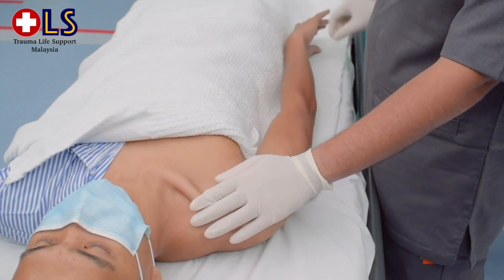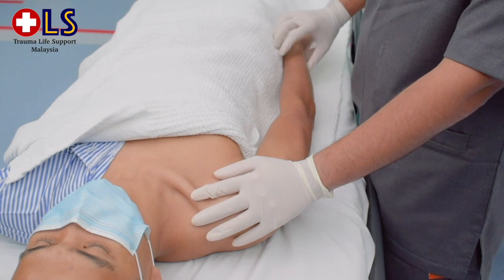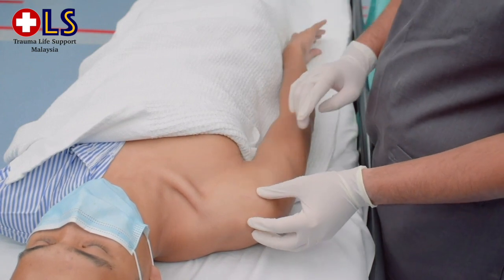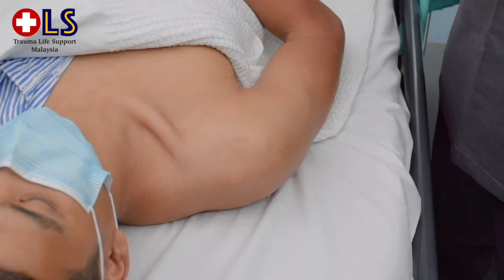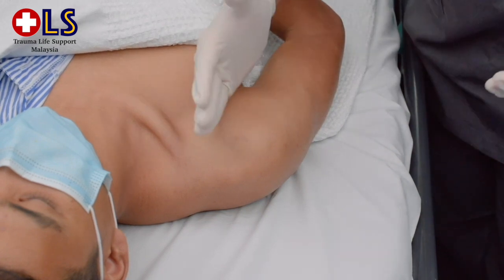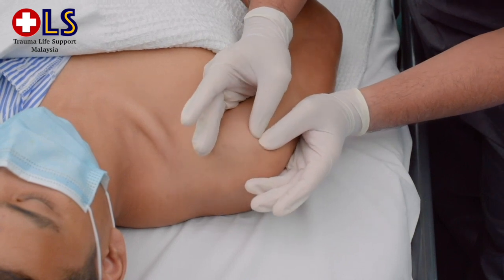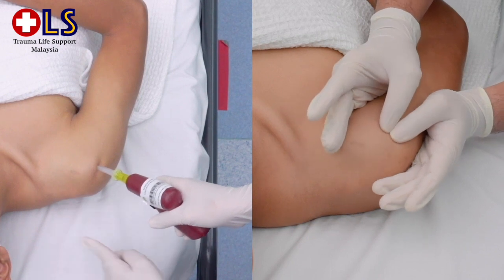For the specific target area, the area that feels like a ball under your palm while moving the arm is the general target area. You should be able to feel this ball by pushing deeply, even in obese patients. To identify the landmark of the insertion site, place the ulnar aspect of your hand vertically over the axilla, then place the ulnar aspect of your other hand along the midline of the upper arm laterally. Place your thumbs together over the arm and palpate deeply up the humerus to the surgical neck. This may feel like a golf ball on a tee — the spot where the ball meets the tee is the surgical neck.